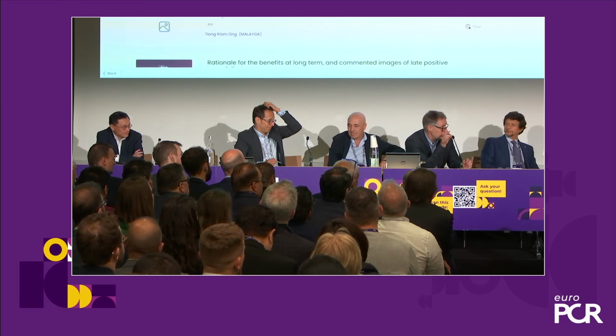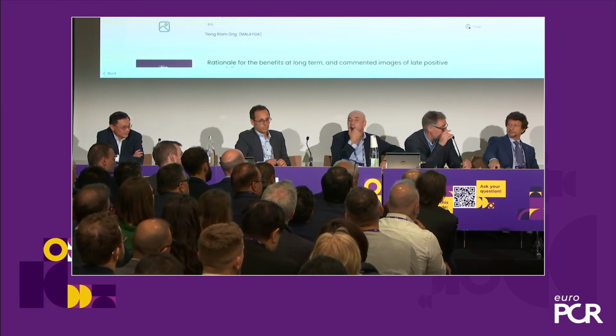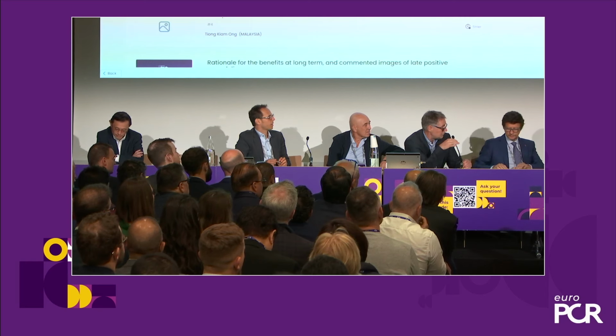We have a short question from the audience: do you think that in the case of STEMI with thrombus, there's enough drug transfer to the vessel wall? Yeah, so I don't know the answer to that, but what I've certainly been doing is using thrombus extraction quite liberally, because of course if you just apply drug to thrombus, the thrombus is going to wash away. My approach to STEMI has changed completely. So it's now thrombus aspiration, delivery of a glycoprotein inhibitor, and then application, once we've dilated the vessel, of a drug-coated balloon. And I'm really impressed by the results.